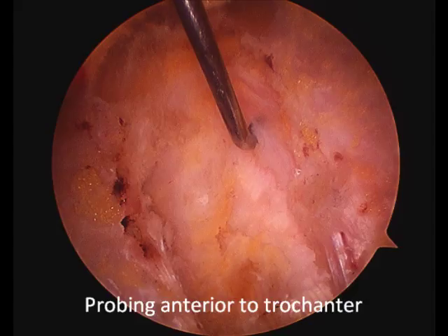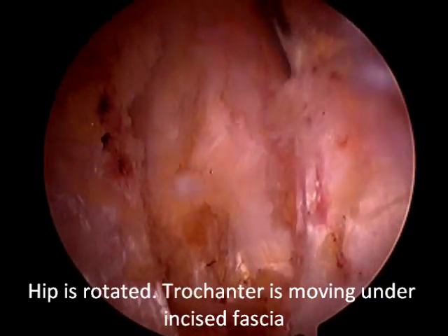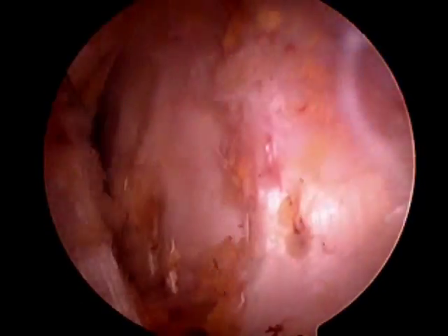Next, the bursectomy is performed, and you can see the fibers of the underlying vastus lateralis muscle. Here is a video showing the hip being rotated, and you can see the trochanter moving underneath the fascia very easily.